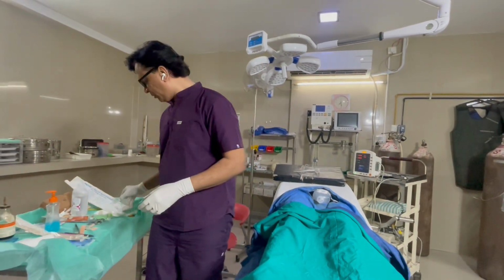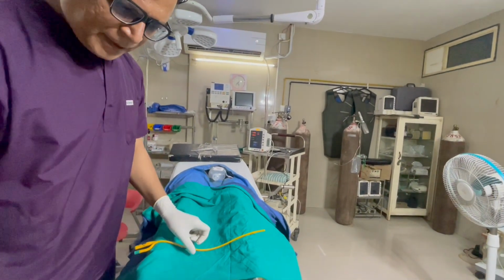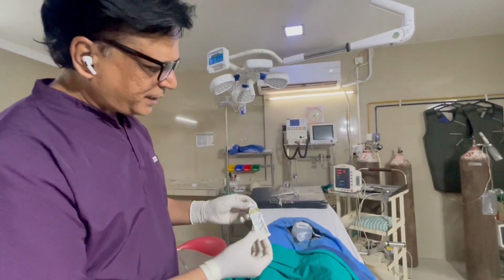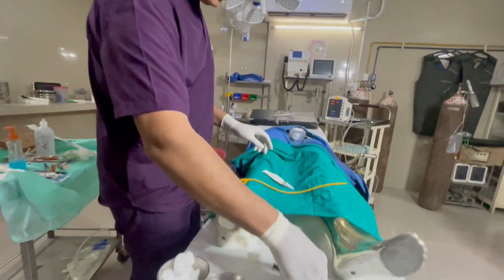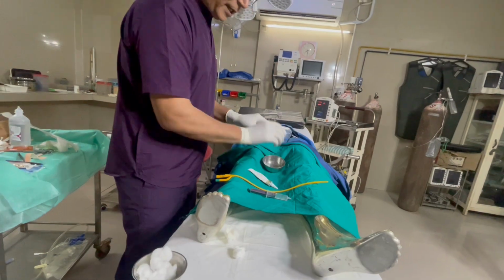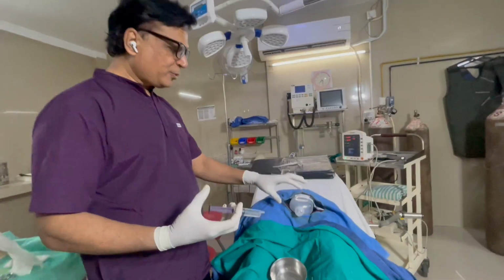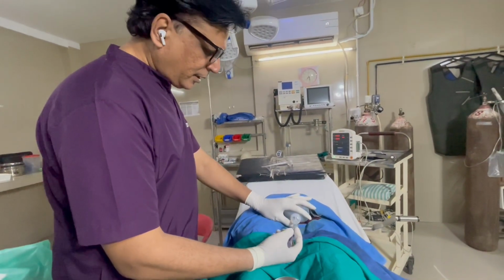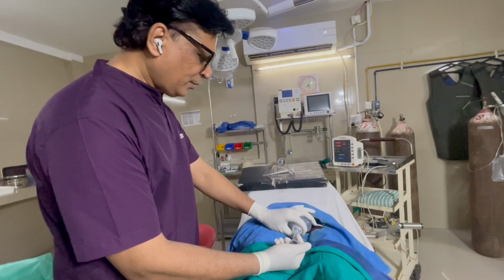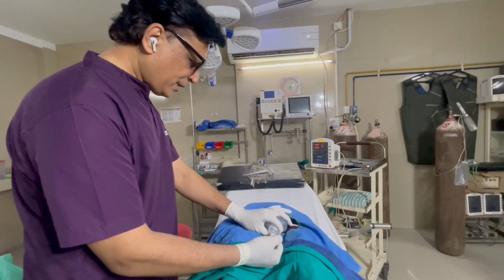So then I will be using xylocaine jelly and looking at the expiry date. It's again December 28, and then I will be keeping the sterile water and kidney tray in between the legs. So Mr. David, I will be pushing the numbing agent inside your penis. So you will be feeling a little bit uncomfortable, but it will give you a numb sensation, so that it will be easy. Is it okay? Yeah. So I am putting it now.